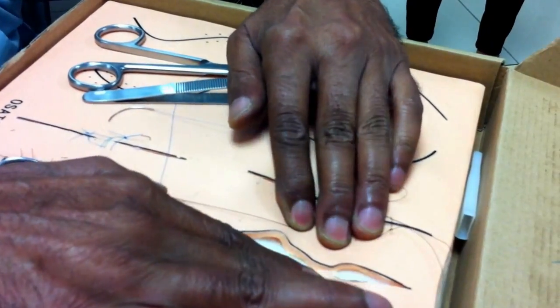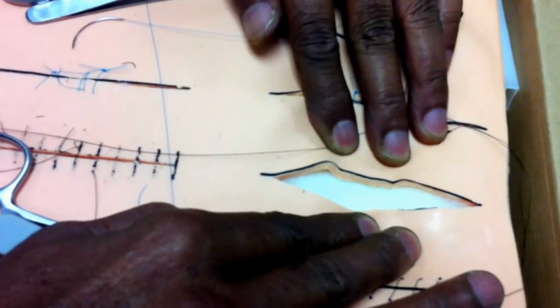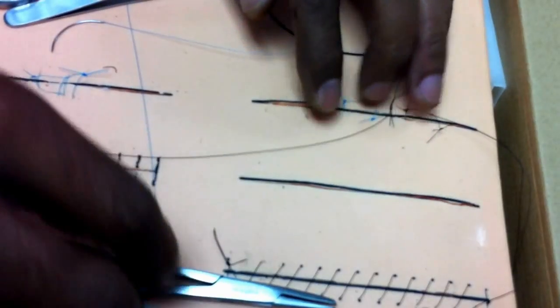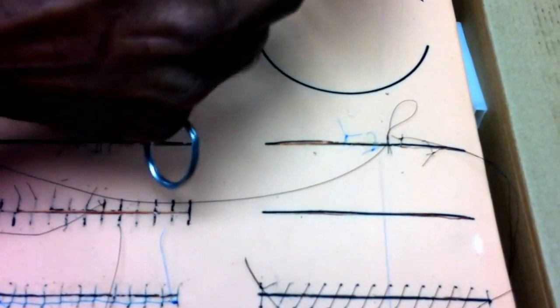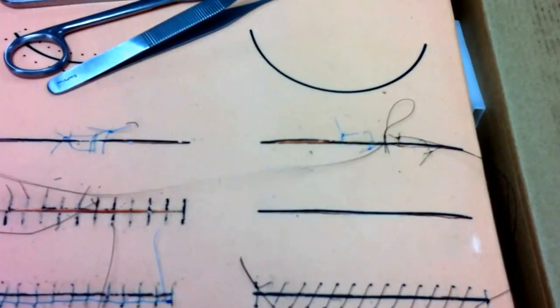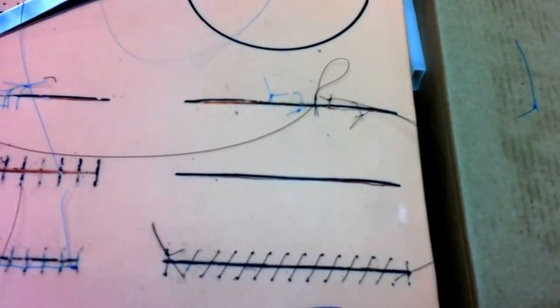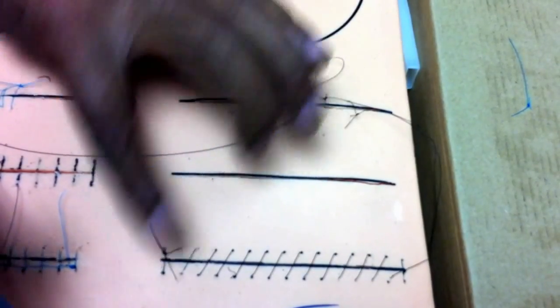And you can see this is exactly the texture of skin, and this is how the skin separates. So we have made a skin incision. Now what I'm going to demonstrate to you is how to suture the skin incision. Today we're going to do the simplest technique, the continuous suturing technique, the one which is shown here.